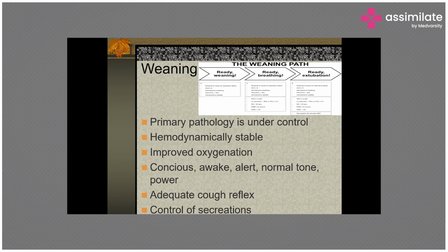And infections, pneumonia, ventilator associated infections can also contribute to the patient's delayed recovery from the support, and the patient's stay in the hospital will get prolonged. And in the bargain, the cost of the treatment also gets very high if the patient remains on ventilator for a long time.